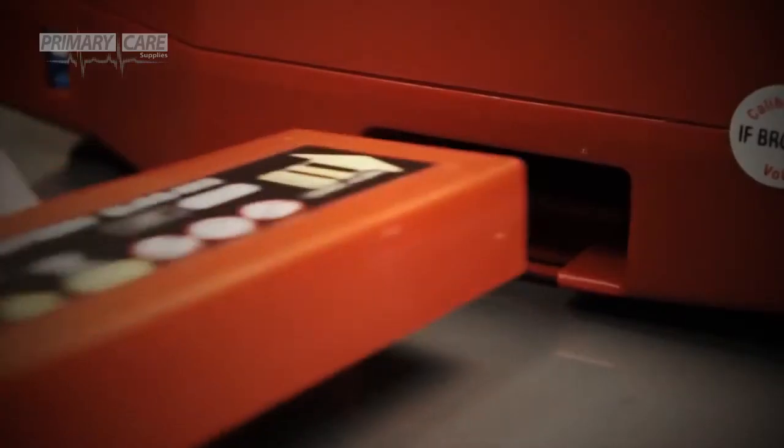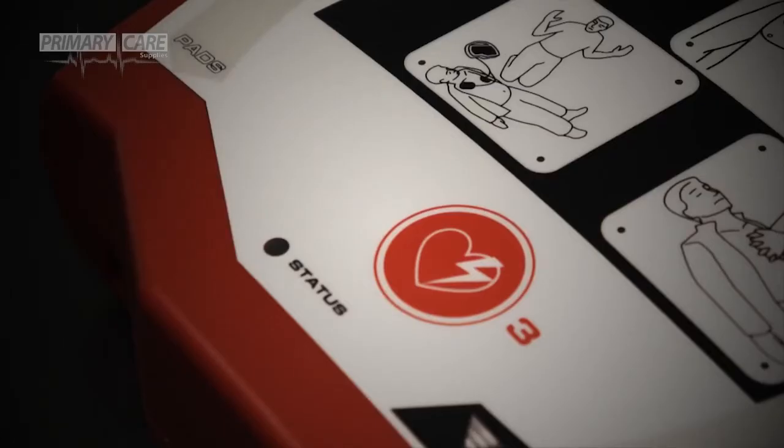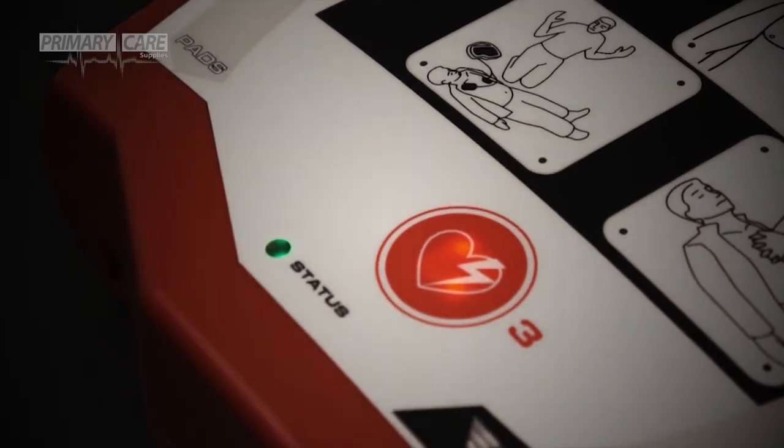When the Rescue Sam arrives, setting up the machine is easy. Simply insert the battery into the base of the defibrillator. The status indicator will light up green and a voice prompt will ask you to press the red shock button to complete a self-test: "Self-test, press the red shock button."